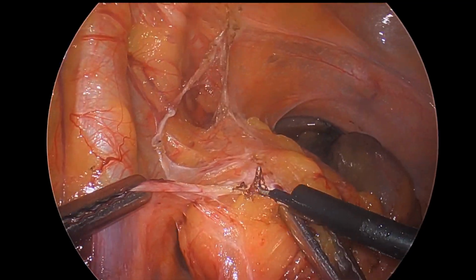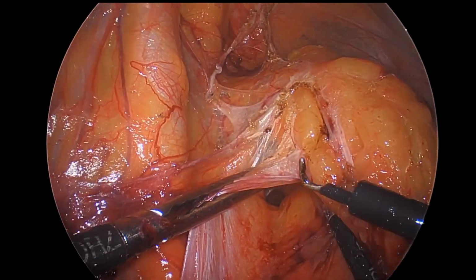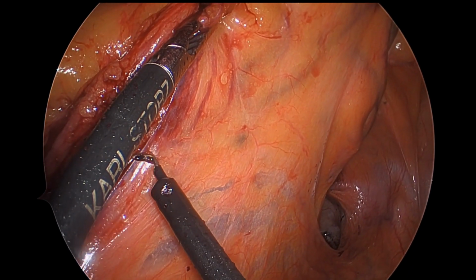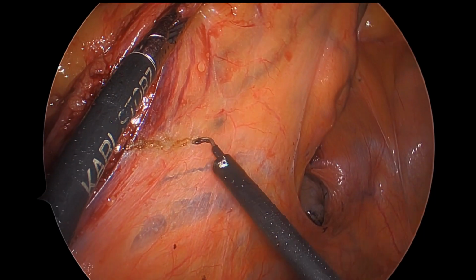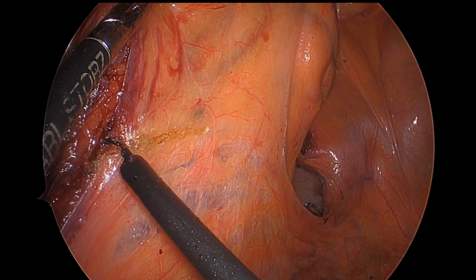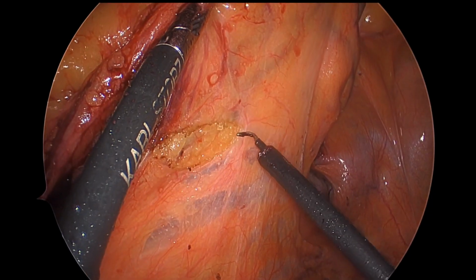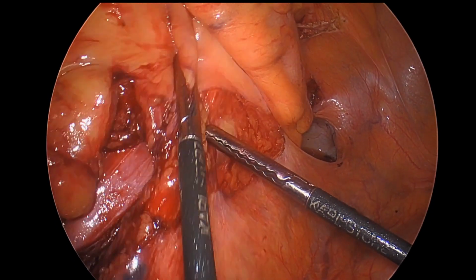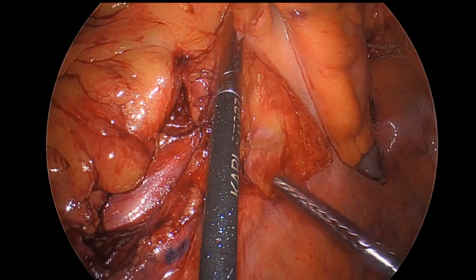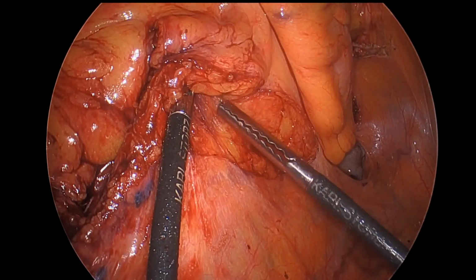This patient, again, we're doing the low anterior resection for cancer, but the patient must have had some episodes of diverticulitis or has some congenital adhesions in that plane. Now we're actually establishing the true plane under the IMA pedicle. And in a moment, you're going to see that we establish the correct plane towards the mesorectum. I'm bluntly sweeping away the retroperitoneum here. Again, just being careful as we're still not quite sure of the anatomy here.